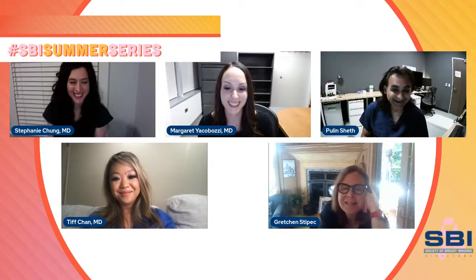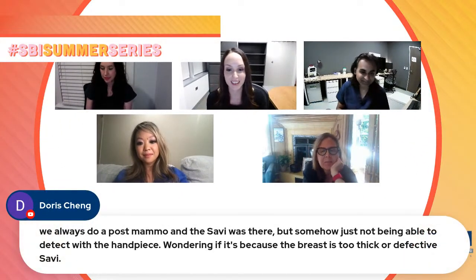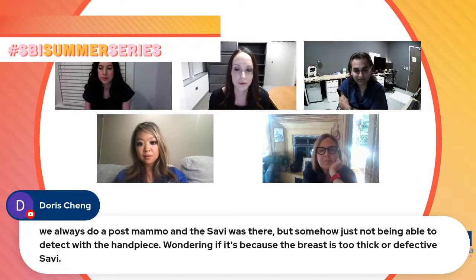Wonderful. What clip do you guys use otherwise? I actually use it on everybody. Oh, you do it on everything? We use a Hydromark, and it seems like we normally see it, but sometimes not, but as a general rule, we do see it pretty well. Does anybody else use Hydromark? No. Used to, but surgeons don't like it. Sometimes it slips out in the OR, and we've had migration issues when we placed it. So that's the only reason we didn't use that.